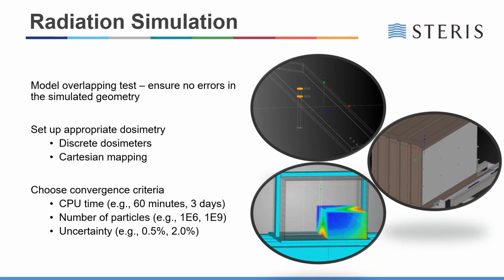And given this level of accuracy, that we're able to see precisely where the overlaps are, I will make a note here about defeaturing. You can consider that there will be some features within products and systems that are not necessarily impactful from a radiation dose perspective, but are certainly impactful from a mechanical design perspective. So routinely, components that are not included in radiation models, such as fasteners or screws, small engineering features, control system switches, and so on, would be excluded.